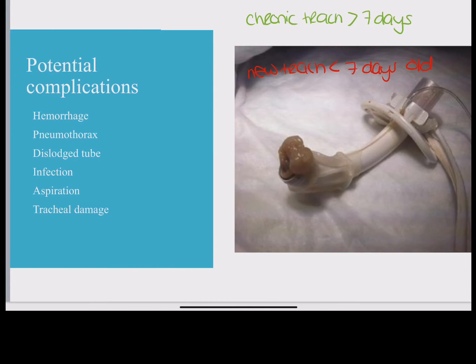Ideally, you want a nice, clean, fresh tube, but if the current tube is all you've got, then don't worry about it. Your patient is compromised at this point. Once you establish that tube, you can change it later.